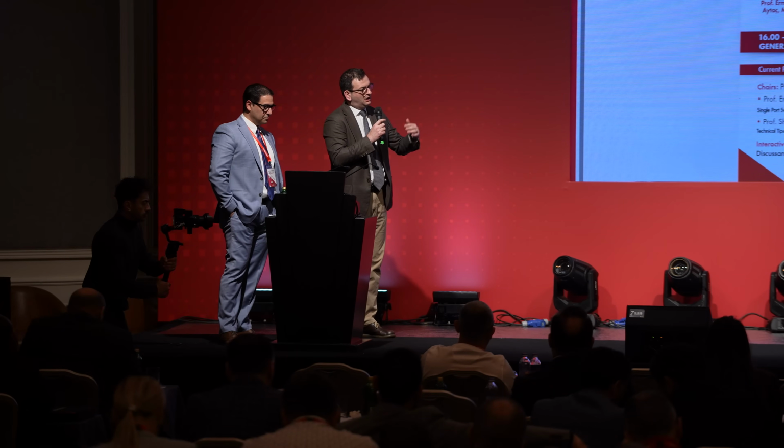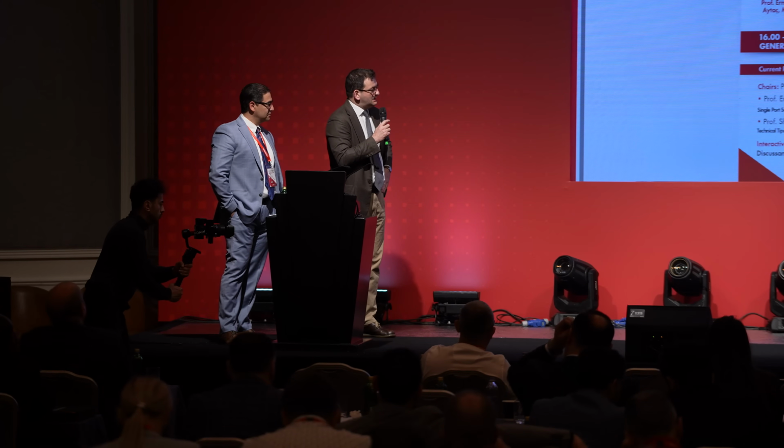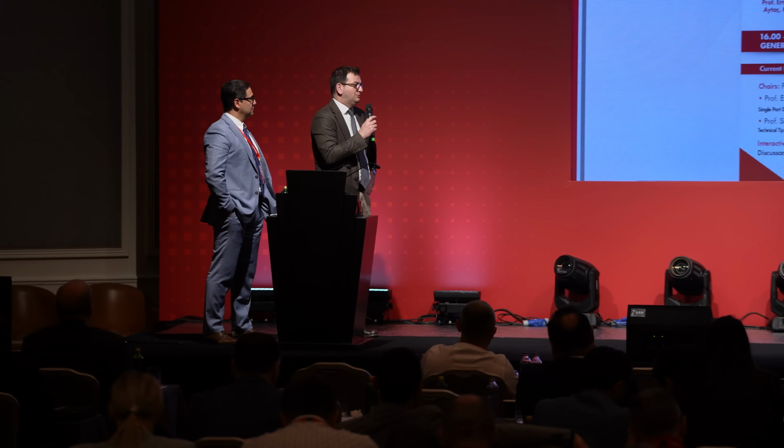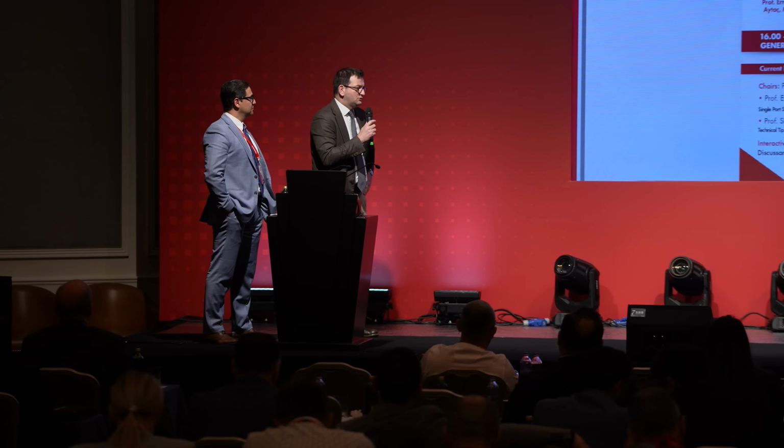Of course. I would definitely go with the robotic surgery for rectal cancer. For me, there is no question unless there is another limitation, because robotic vision also created an opportunity to understand lower rectal anatomy much better compared to laparoscopic surgery, because the visualization capacity is higher, and it gives us the opportunity to do many maneuvers for dissecting especially the lower tumors, which you just basically cannot do with laparoscopy, and I'm an experienced laparoscopic surgeon also.